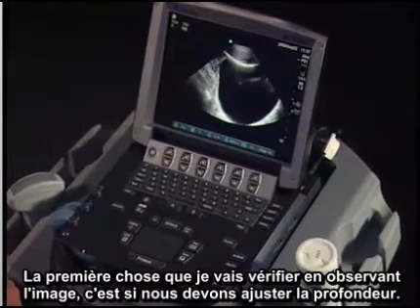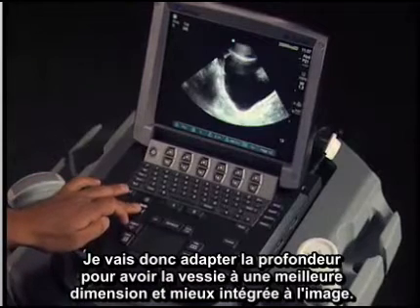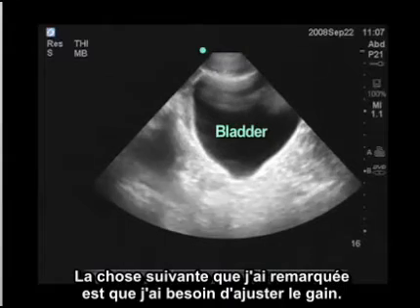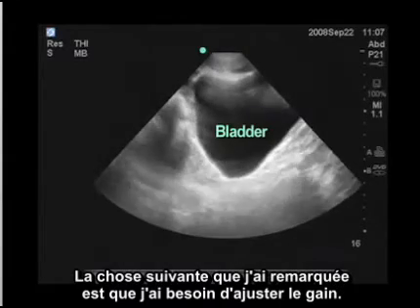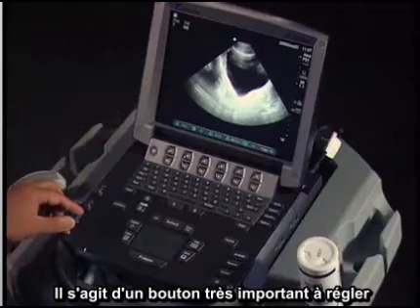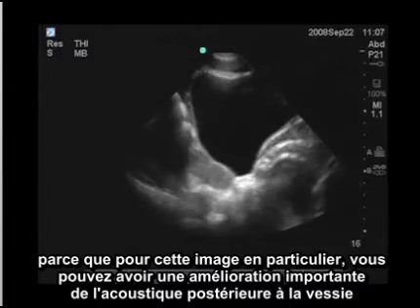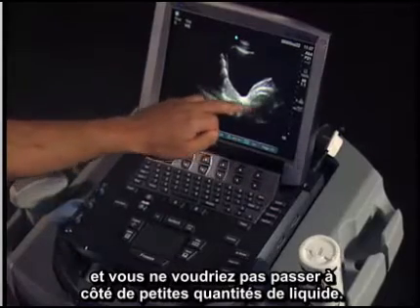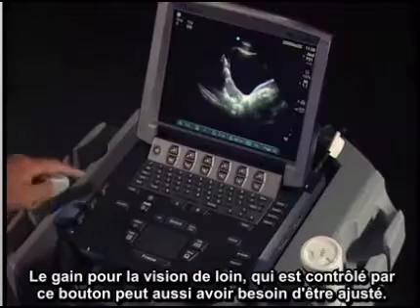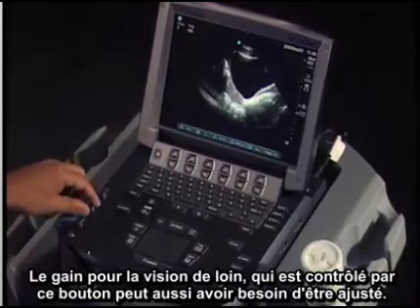We can see a pretty large bladder here. First, I'll adjust our depth to make the bladder fit better within the image. The next thing to adjust is the gain — this is a very important knob, because in this view particularly you can have a lot of acoustic enhancement posterior to the bladder and we don't want to miss small amounts of fluid. The far gain knob may need to be adjusted additionally.